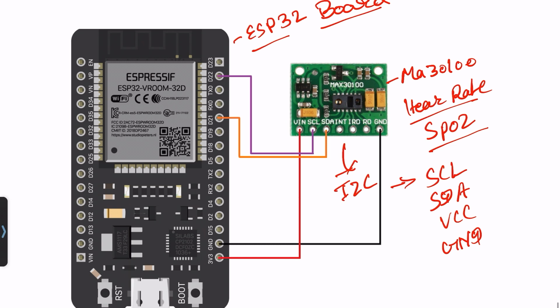SCL will be connected to pin number D22. SDA will be connected to pin number D21. VCC will be connected to the 5 volt VIN pin or 3.3 volt. Ground will be connected to ground.